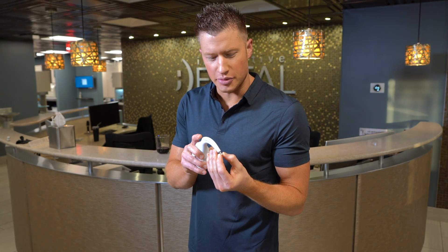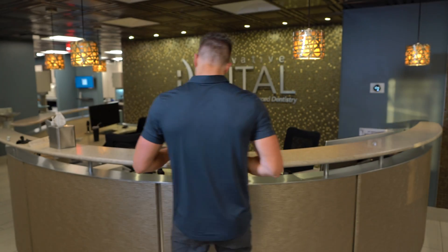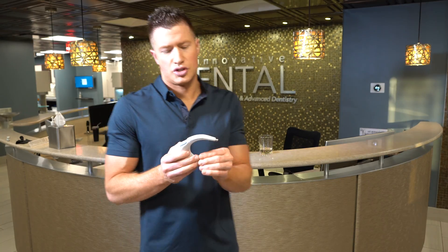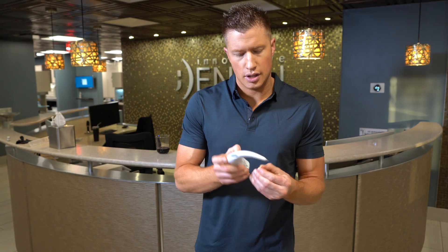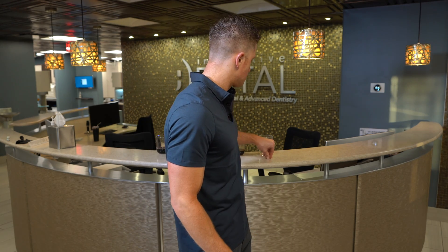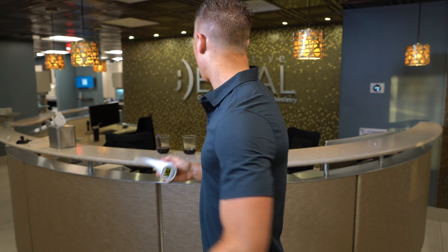Let's check out the porcelain veneer that was in the wine — shade B1, didn't change at all. The porcelain veneer that was in the Coke — B1 as well, no change. The one in the tea — B1. Coffee espresso — B1, no change. Do I really need to do the water? Come on, water's not going to change anything — but just for giggles: B1. All of our veneers didn't change any shade. We stayed at B1 with all the porcelain veneers.